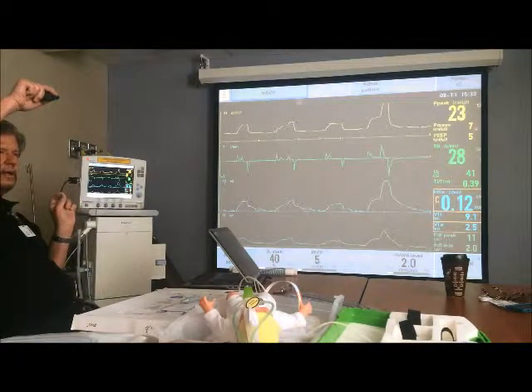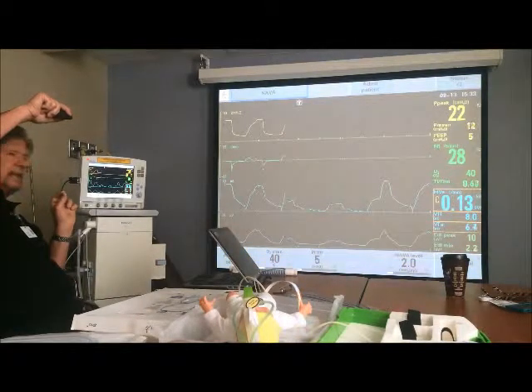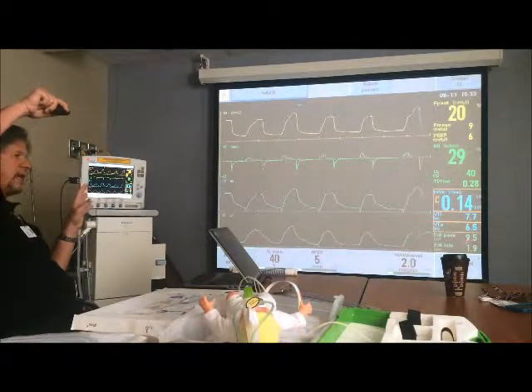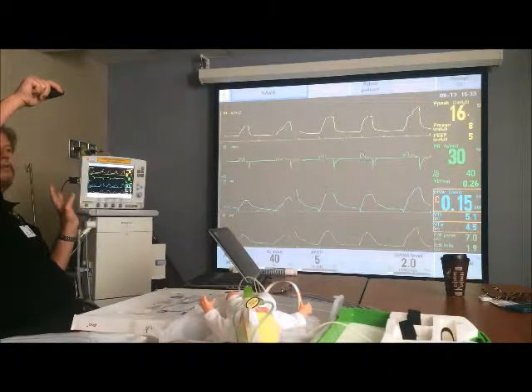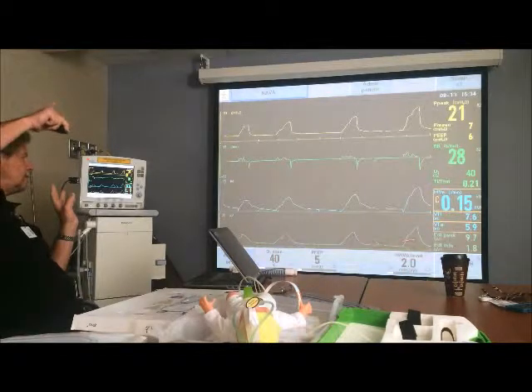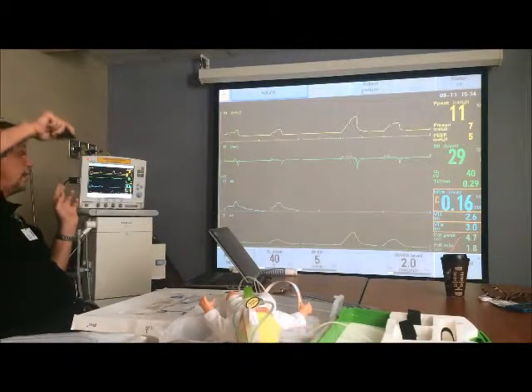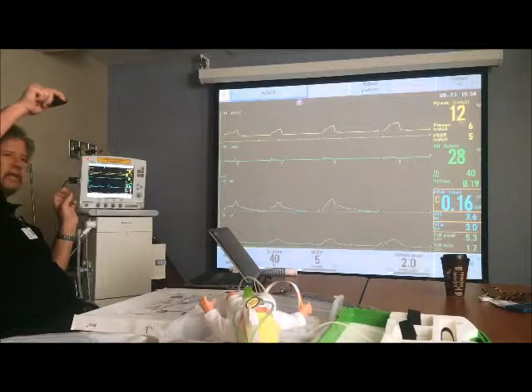Follow that? Remember, the reality is it's really this number minus that number, but I'm just saying if this is 0, 2 times 10 is 20, plus the 5 a PEEP would have given us on that breath a PIP of 25. 2 times 8 plus the 5 a PEEP on that breath would have given us 16, or 21. 2 times 4, 8 plus 5 would have been 13.